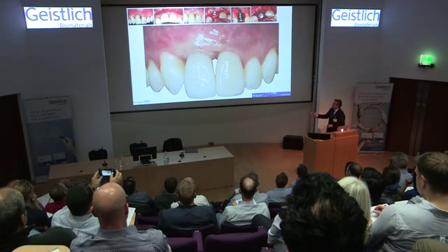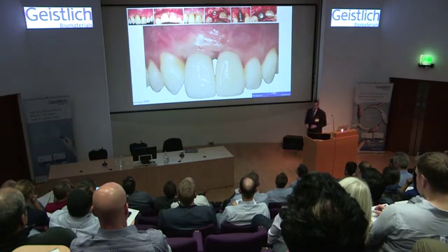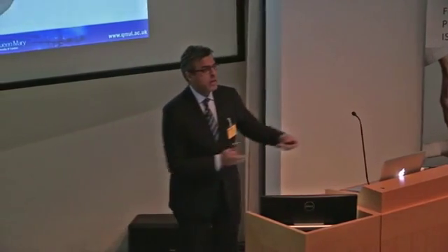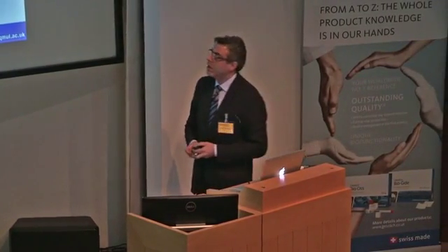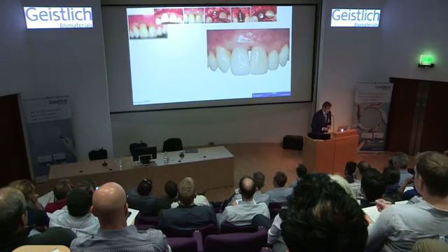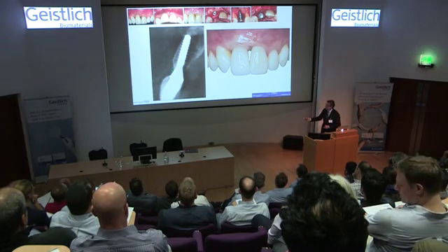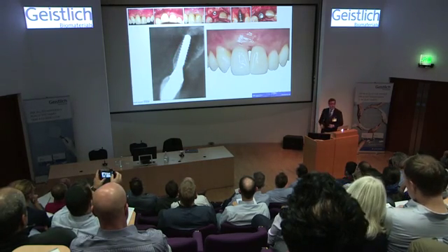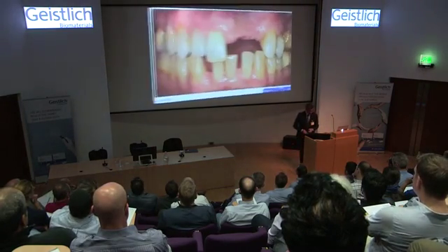And I think what we had set out to establish in the beginning was to get this level right. In fact, we probably overcorrected it slightly. The papilla was never going to be regenerated in this case. So this is a case of an iliac crest bone graft, and how things can go wrong and how we need to correct things these days. Now, moving on, if you look at the CBCT scan of the same patient now, we now have beautiful bone re-established buccally and has been regenerated using the particulate bovine bone graft.